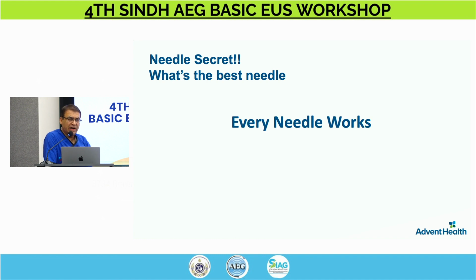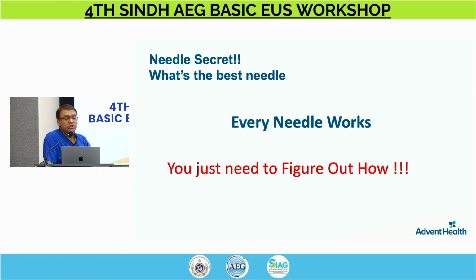So what I say is every needle works. You just need to figure out how. That does not mean every needle performs equally. So there is a little bit of difference on what type of needle you are using, what technique you are using, and what technique works for you. But just whatever is available to you, just figure out how to make it work.